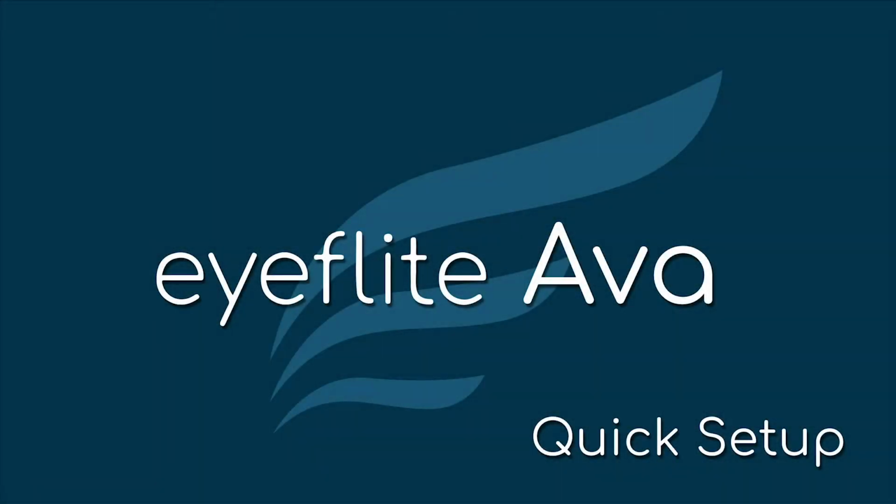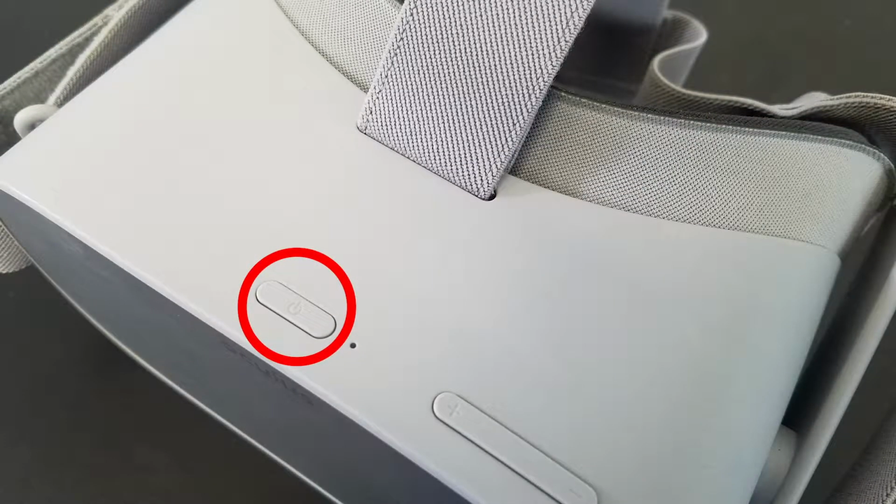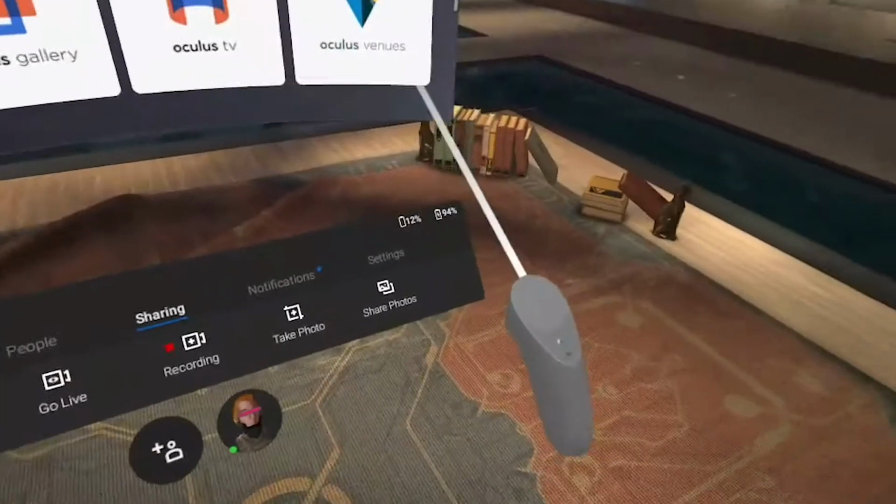Hi, this video will show you, the caregiver, how to set up Eyeflite Ava for your user. First, you'll want to put the Oculus Go on your head and make sure it's powered on. If it's off, hold down the power button on the top of the headset. If it's just asleep, tap the power button once and you should see a gray screen.